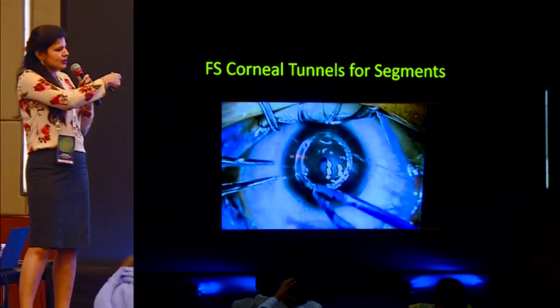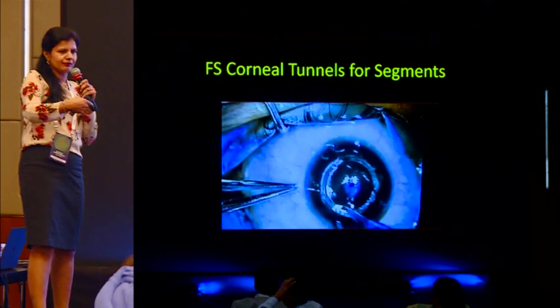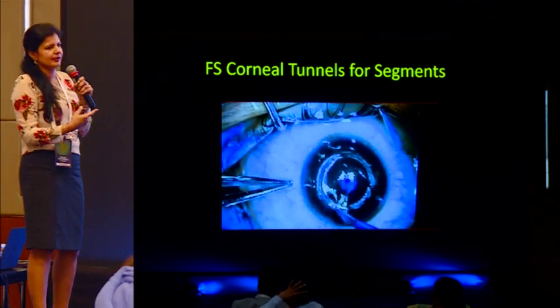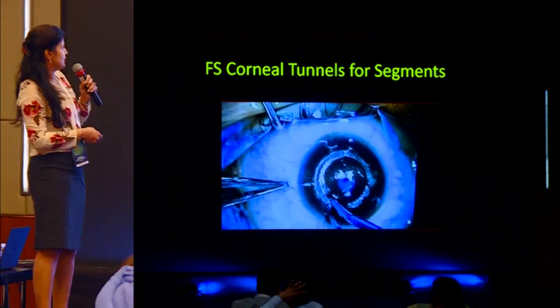And once that goes in safe, it is pushed a further 1 to 2 millimeter into the channel rather than staying on the platform level, and you end up with a 10-0 MFN suture in that region where the incision was made to prevent further extrusion.